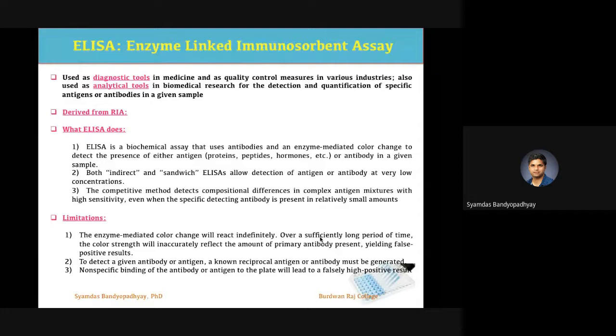However, with the advent of modern techniques, we have been able to overcome those limitations. So you can always stop the reaction using certain chemicals, right? You can stop the reaction and make the intensity fixed at that particular time, which you can easily measure using a detection system.